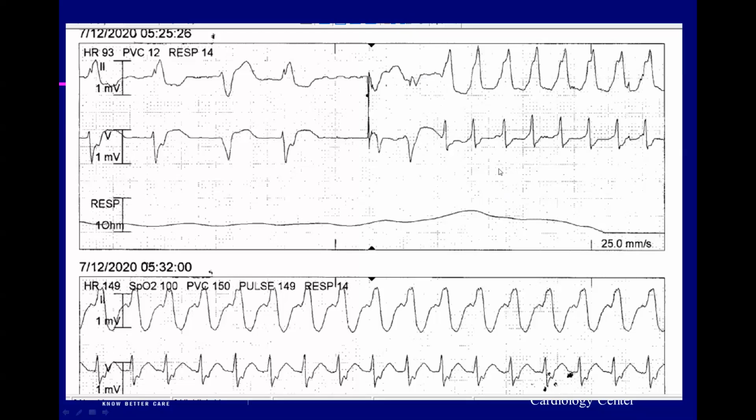So this is 100% ventricular tachycardia, because now you have a very, very regular tachycardia, while the patient here was in atrial fibrillation. So you would have to explain, how does atrial fibrillation with aberrant conduction suddenly become regular? Everything screams in this tracing, this is ventricular tachycardia without a doubt, right? Often if you have a tracing like this, you would look for AV dissociation, because you only have 2 leads available and the diagnosis is much more difficult. In this case, I think it's pretty clear your QRS complex is so wide that it's very likely VT, but you would look for AV dissociation. In this case, you have atrial fibrillation as underlying rhythm. Guess what? You won't see AV dissociation, which makes the interpretation a little bit more difficult. But I think we have enough information here that you can very confidently say this is ventricular tachycardia.